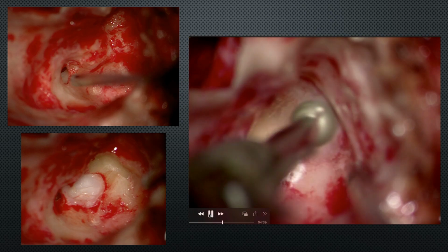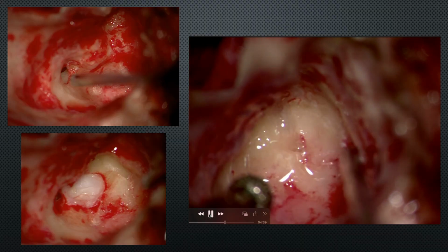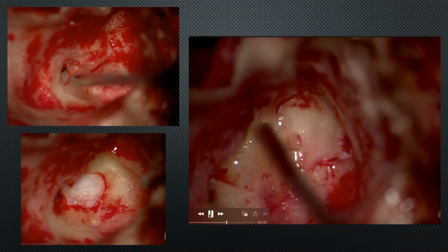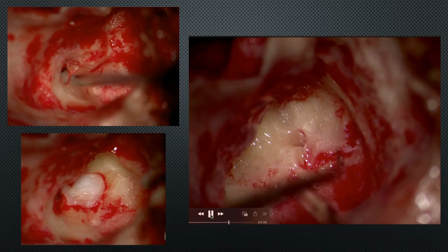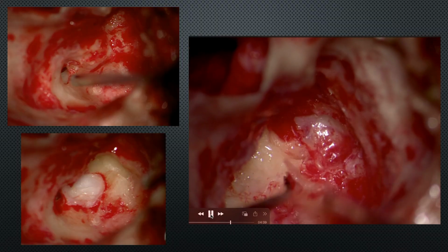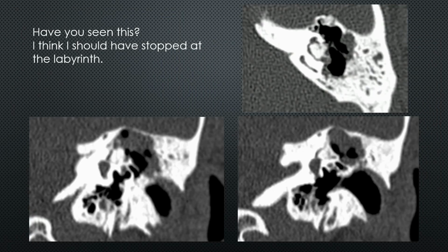But one of my questions with this one is, I'll let this play out here a second. That's otocapsule bone. And a multifunctional suction. You can lift bone off with it. But just pick this up, and there's skin. This is very clearly skin. That's a little less clear, but it's very unusual. I thought it was unusual.